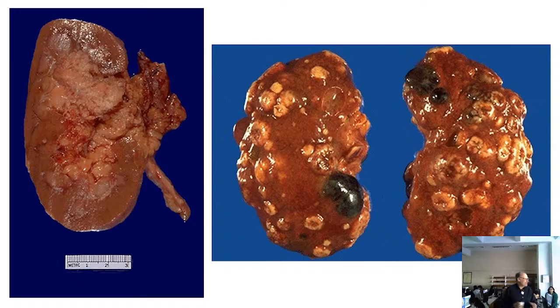Okay? So this is a urothelial carcinoma, similar to the ones that form in the ureter, in the urinary bladder, urothelial carcinomas. And I want you to see all these neoplastic lesions in both kidneys, and there are also some cysts of no importance, simple cysts, but you see that some of the lesions have this sort of umbilication because of necrosis.